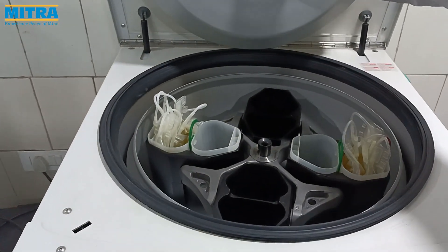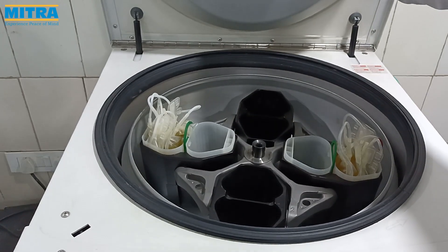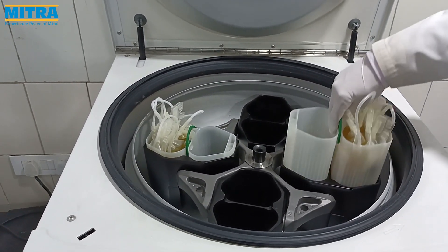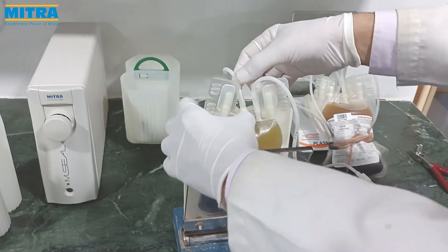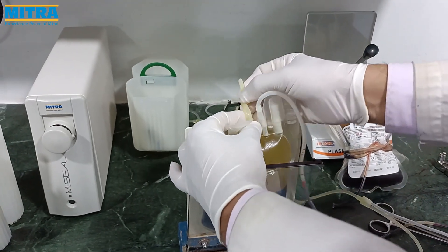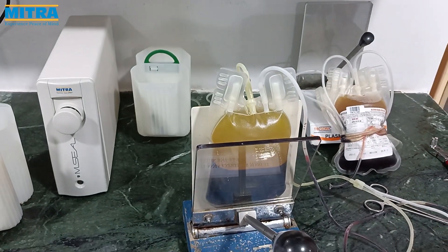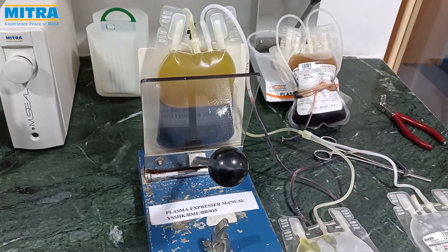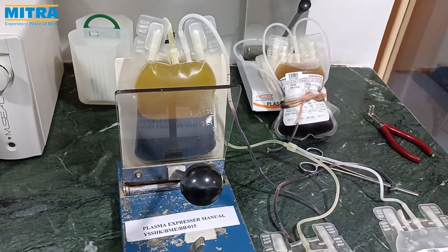First, we put the main bag on the expressor as shown here. Then we break the breakaway valve. As we can see, platelet-rich plasma is transferring from the main bag into the platelet bag.